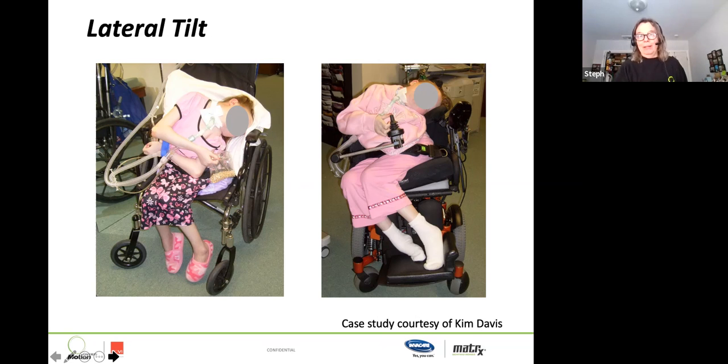This is not a correctable type of orthopedic change. This is years of not just collapse, but also that rotational component that happens so often with a maximum degree of scoliosis that it becomes a rotoscoliosis. But it was really just a little bit that has some really incredible benefits for a lot of consumers.